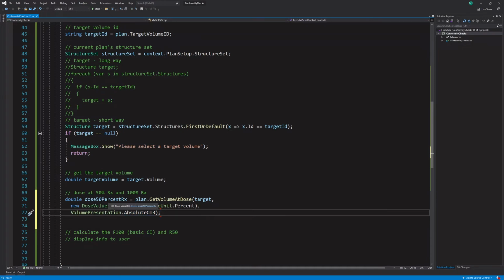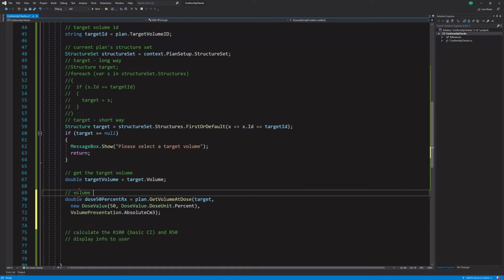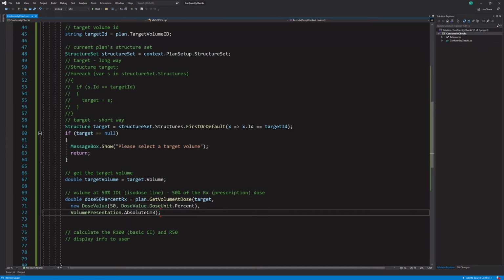And so we're returning the, okay. Yeah, see, I wrote this comment wrong. So we want the volume at 50. So we'll do one comment for each one. The 50% IDL or isodose line. Okay, and this is 50% of the Rx prescription dose. Okay. All right.